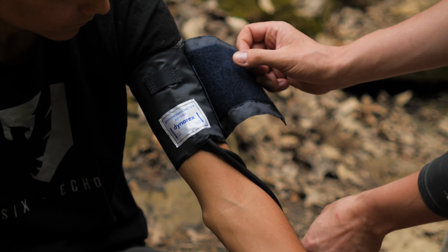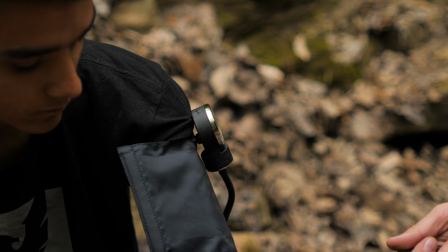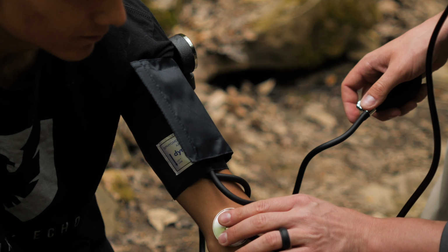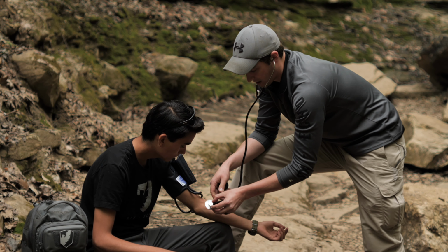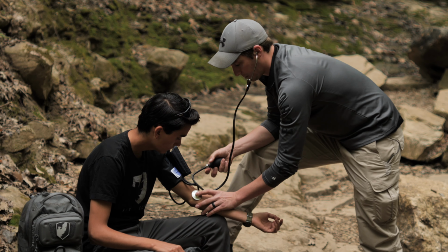I'm going to take the gauge here and I'm going to clip this onto a shirt or something so that it's up out of the way. I'll go ahead and put my stethoscope in my ears. Now I'm going to take the end of the stethoscope and I'm going to place that on the brachial artery. If you take the center of the arm here and you move just to the inside, that's about where the brachial artery is going to be. So I'm going to slide this directly on top, put firm pressure, and now I'm going to pump this up.